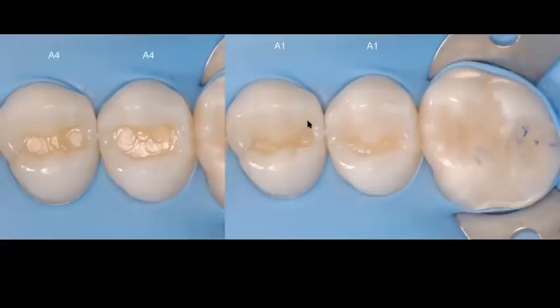So you can see here, I am building now my buccal cusp, with a very little amount of composite. I am literally using a thin cord packer and an explorer, you can see that I've bonded this to the buccal cusp, and I'm creating a little bit of secondary and tertiary anatomy here with my explorer. I make sure that that blends in nice, and you don't see any transition line between the composite and the actual enamel. And I'm using an A1 shade.